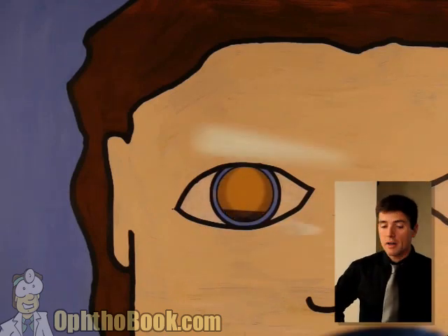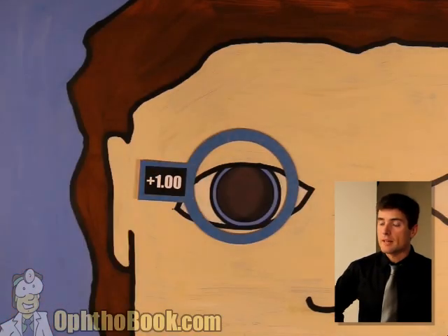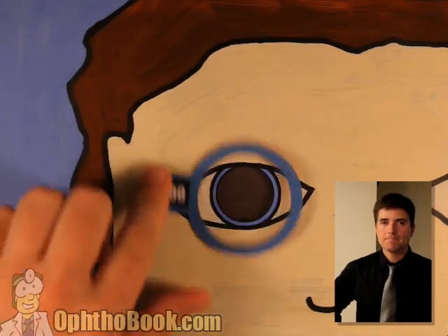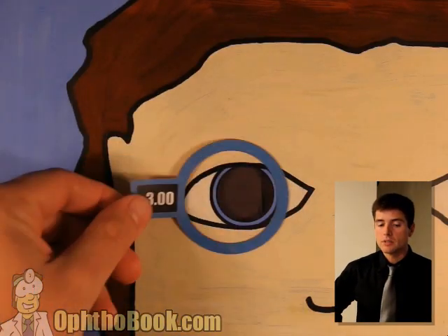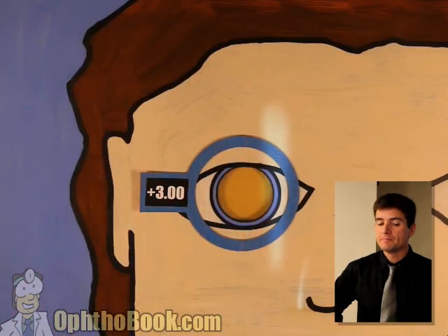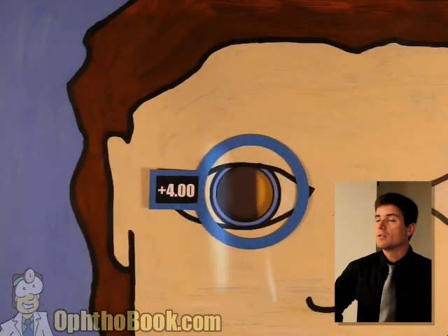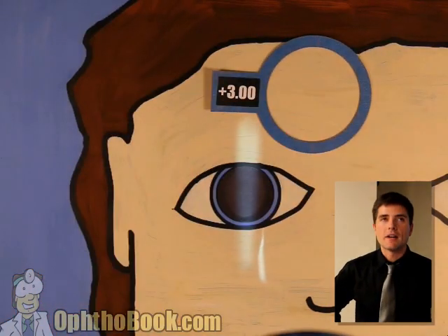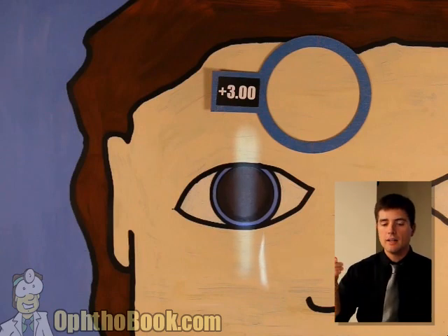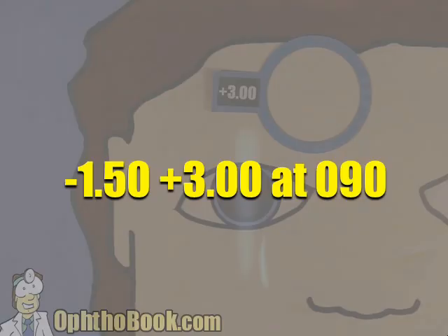Let's do a harder one. I think we got it right off the bat — that's a plano in that direction. We still need some more power the other way. Plus one — not quite there yet. Plus two — getting closer, our reflection is getting larger. Plus three — I think we've got it. Am I getting greedy? Let's try — no, we've gone too far. So get that plus three lens out and lay it on the counter. Our answer is plano plus three at 90. We do the math and the final answer is a minus 1.50 plus three at 90. Perfect.